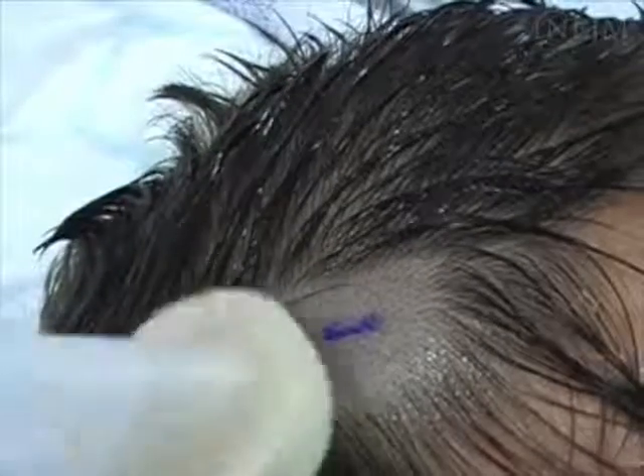Wipe the frontal area three times from the centre to the periphery with an antiseptic solution. Then place a sterile fenestrated drape over the head. Larger sterile drapes may also be used, but follow local guidelines. Raise a bleb with local anaesthetic.